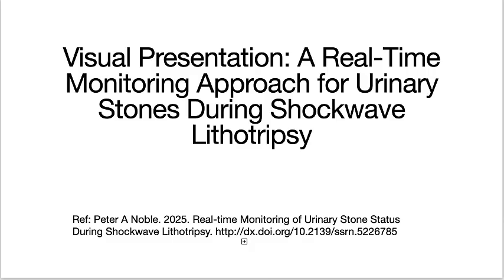Why monitor urinary stones? Why is real-time monitoring needed? We need to monitor the stone during shockwave lithotripsy to ensure it is adequately fragmented for safe passage out of the body while also avoiding overshocking the patient, which could damage surrounding tissues and lead to treatment complications. Real-time monitoring is essential to notify the operator of key treatment milestones, such as when to continue shockwave treatment and when to stop. Does this address your questions?